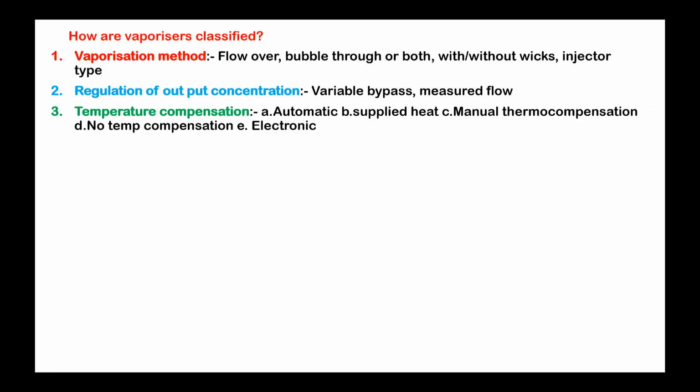what is the name given to the modern vaporizers? All these sevoflurane, isoflurane, desflurane. TEC vaporizer. TEC means temperature compensated. So that is the short form for this TEC vaporizer.